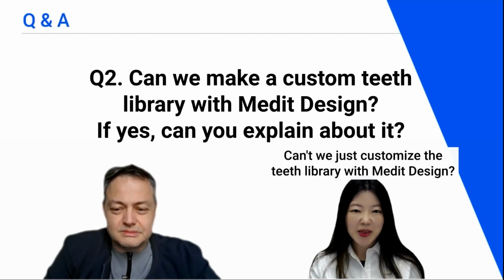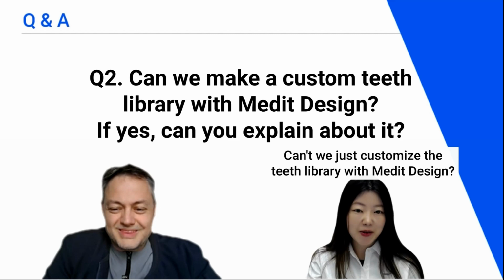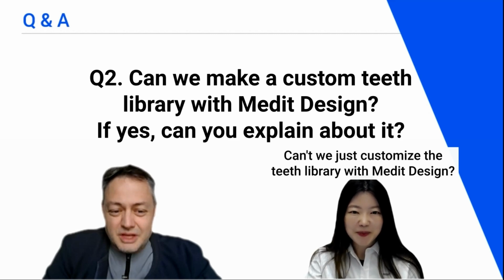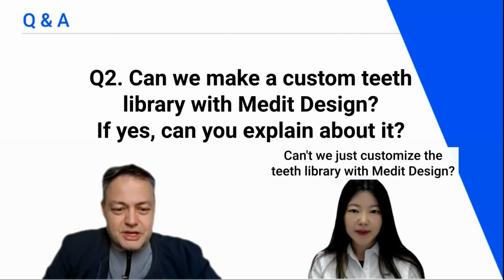Okay. I think there will be so many people thinking like me. So your answer, I think, will be really helpful. I hope so. Yeah. Also, these ways of working are already presented in the webinar. So you'll see there how you can do an occlusal cut, or how you can adapt a tooth to the underlying base. Okay. Okay, last question.